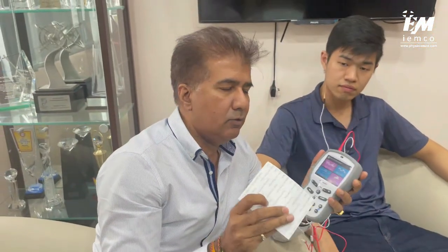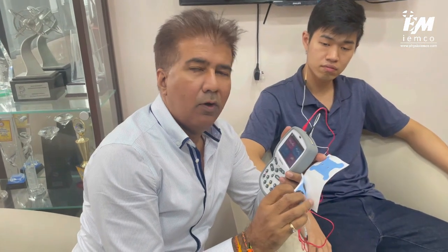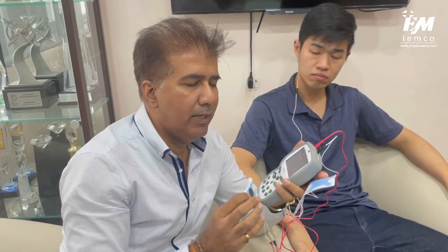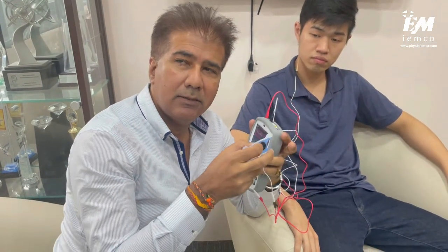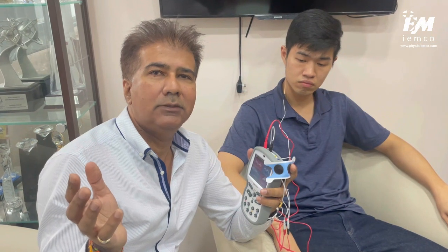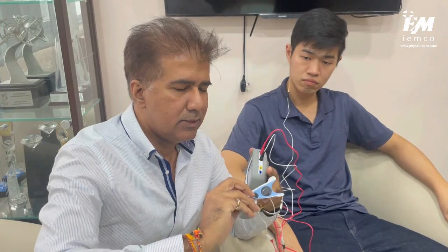Looking at the active electrodes, these are specially designed electrodes for application to the throat surfaces. They have a very nice adhesive plaster that sticks very well, because this area is subjected to a lot of movement when you are swallowing. When movement happens, the electrode can become loose, and if they get loosened the signal quality will be compromised. That's always something we need to take into consideration during application.